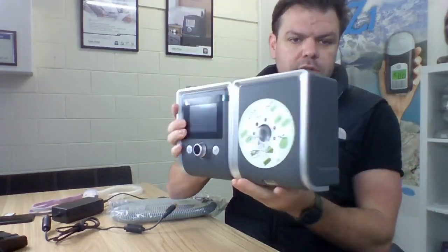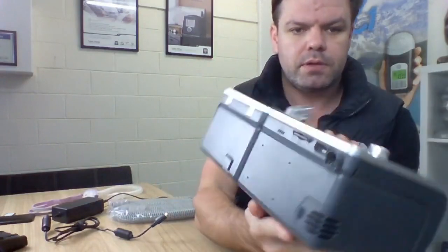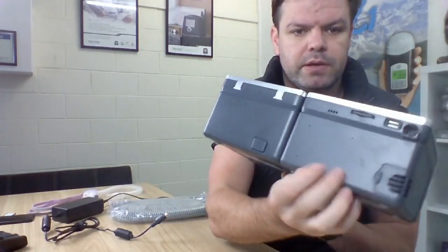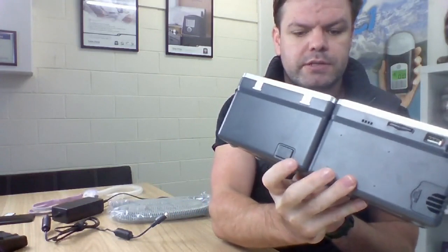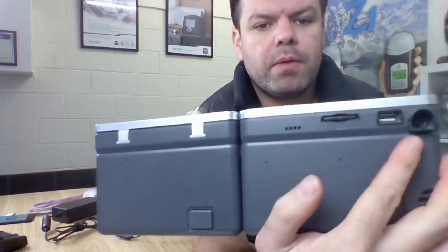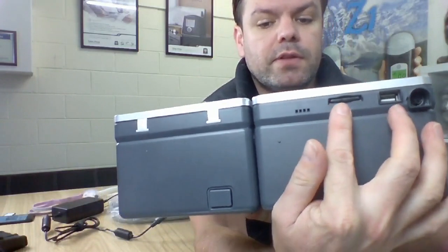And that's your unit. All right, so I'll do a little bit of a pan around here so you can see. That's your inlet there where your filter is. It's that little button I was talking about before to disconnect it. And at the top here you've got your power port, a little USB port, and an SD card, okay, the data side of things.